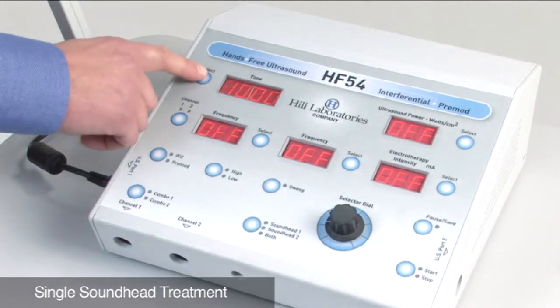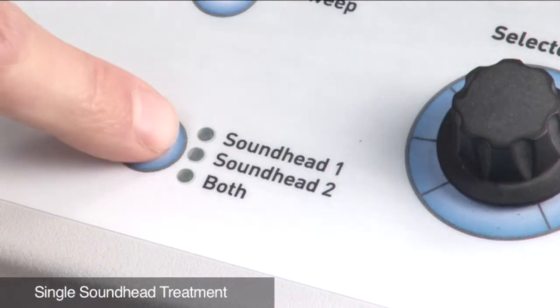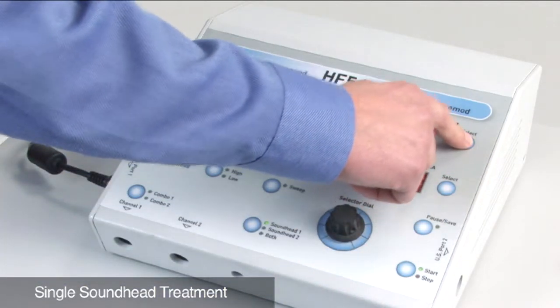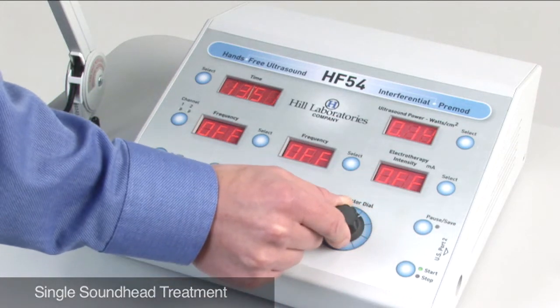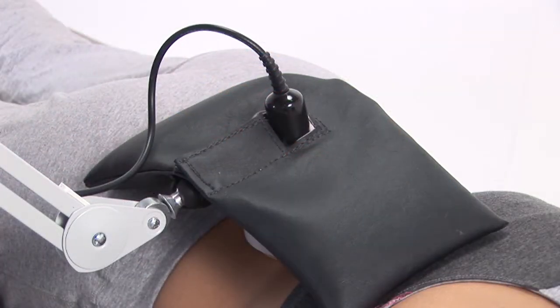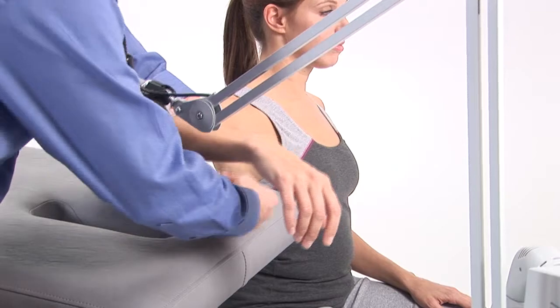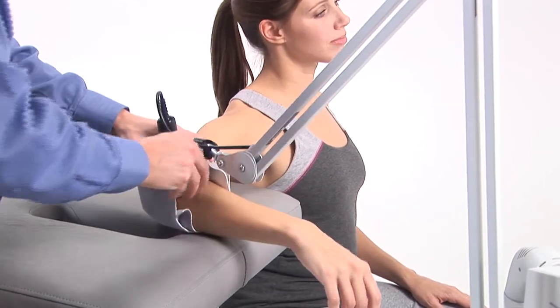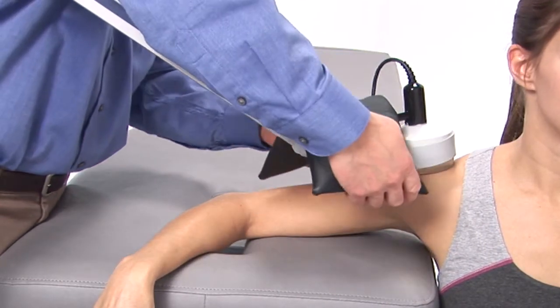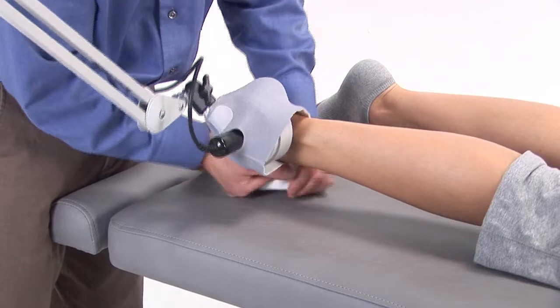Settings for a treatment are simple. Press the time select button and rotate the selector dial to adjust the time of the treatment. Select sound head 1 and press the start button. Select the ultrasound power button and increase the selector dial to the desired ultrasound power. Your patient is now receiving comfortable and safe ultrasound. The provided extremity straps and weight bag will aid in treating such areas as elbows, shoulders, knees, and ankles.